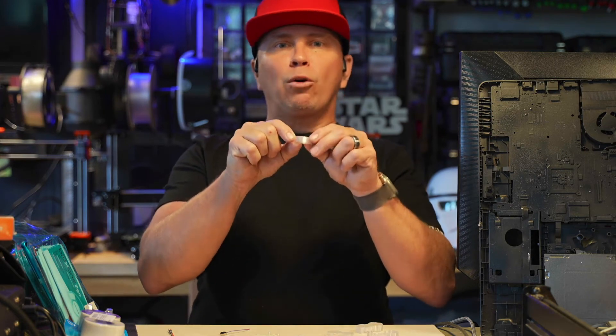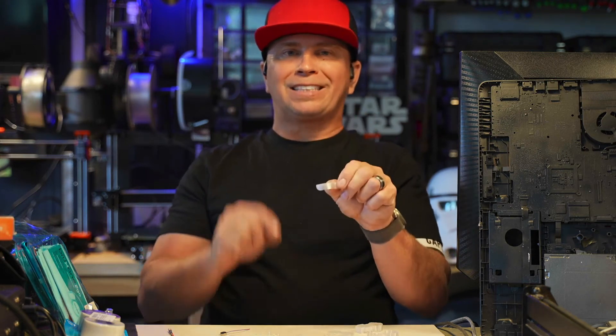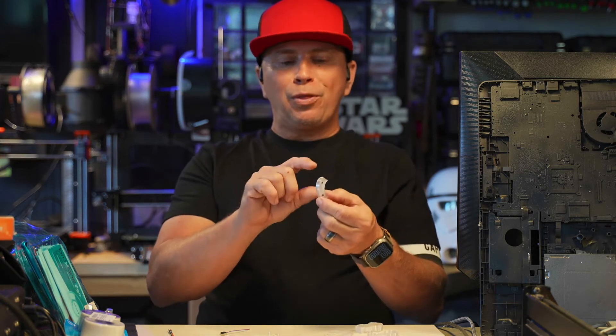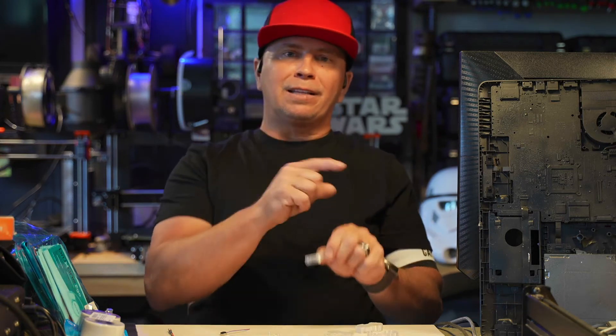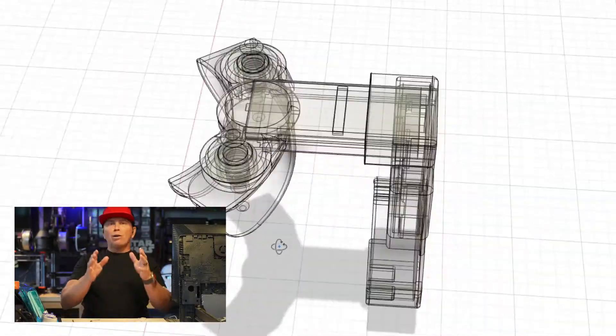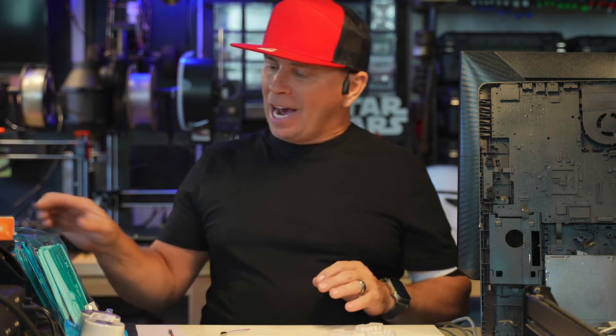The switch will also come with a particular shell that holds a moldable plastic — linked below — that is BPA-free. You put it in and you can mold it to almost anything you want.